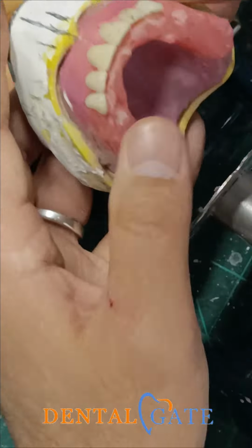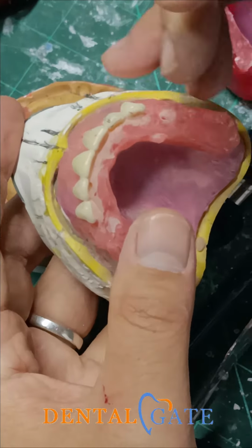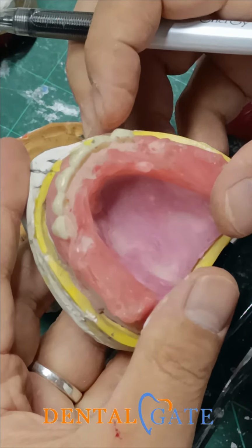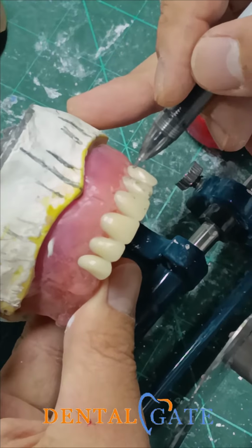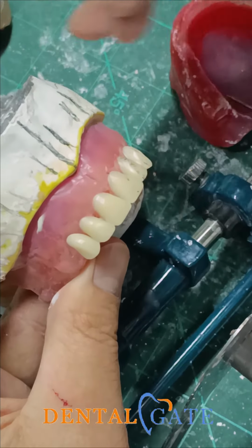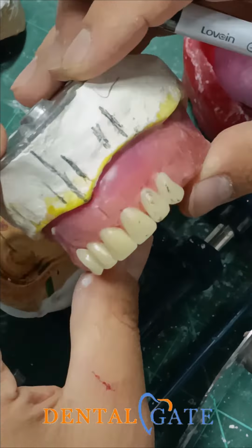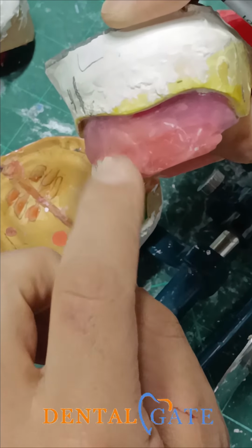But the canine is a very useful or critical position, because in this area we will alter the arrangement to follow the posterior region, okay? So the canine should be just in this area, okay? This segment should be clear from the labial, okay? At the posterior, at the distal aspect, this area should be clear, okay?